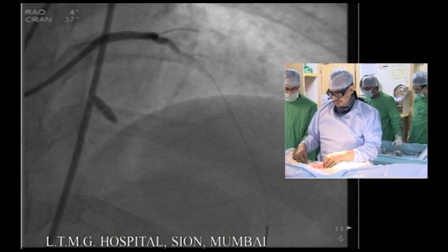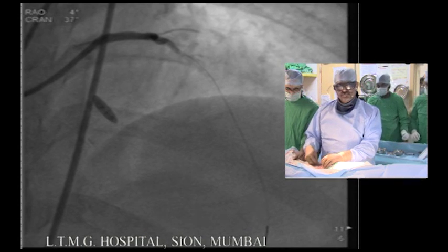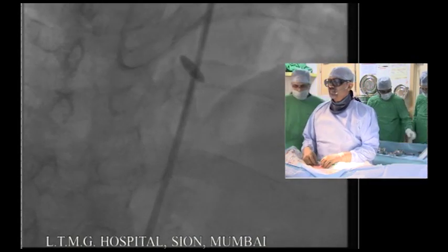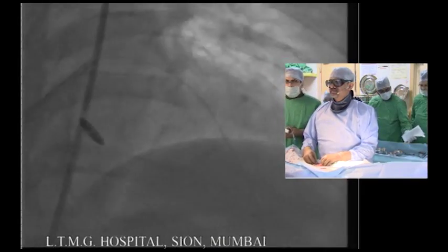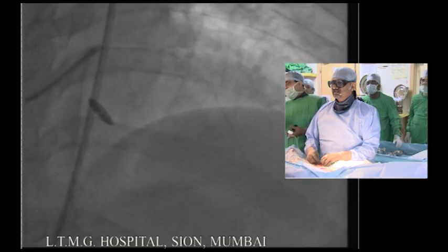Okay, we understand. So I think under the circumstances, if you have a luminal dissection, it is prudent to proceed with the stent and not size it aggressively and then post-dilate or do proximal optimization.